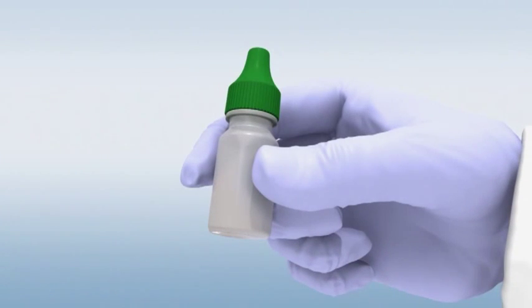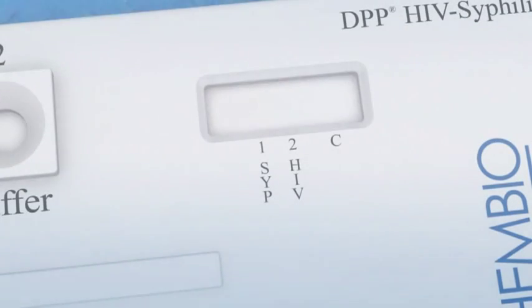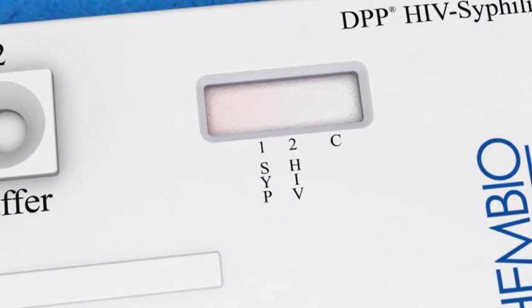Replace the green cap on the running buffer bottle. After about three minutes, a reddish color will spread across the strip in the test window, as a signal that the lines are starting to appear.